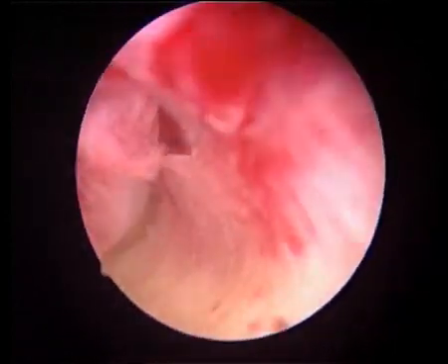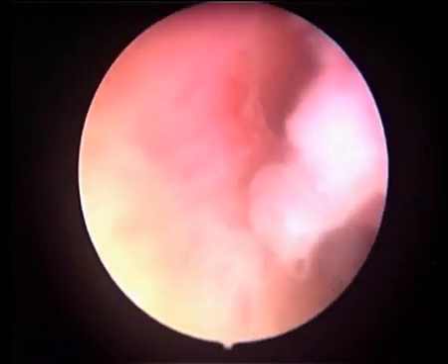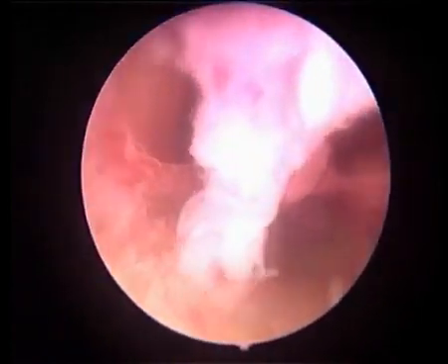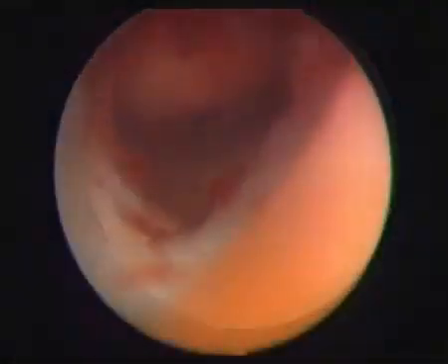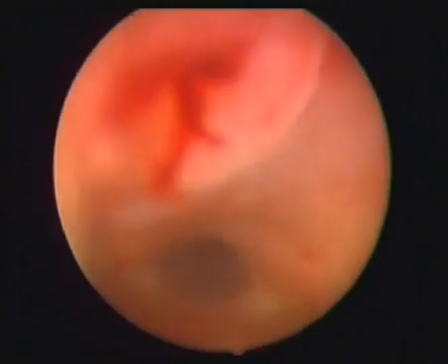In this video clip, the cervical canal is initially in the centre of the screen. The scope is advanced and a false passage is created. The operator then withdraws the scope, realigns the canal in the 6 o'clock position, and the scope can then be advanced into the uterine cavity. In this clip, gentle pressure supplied by the hand pump opens up the cervical canal and the mucus trail can be followed into the uterine cavity.